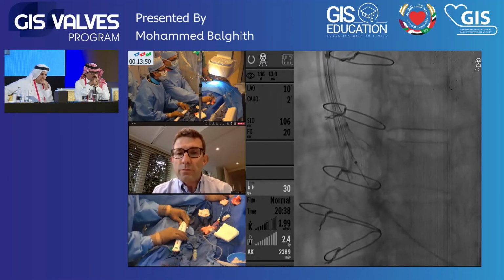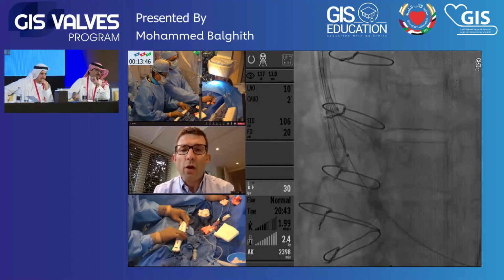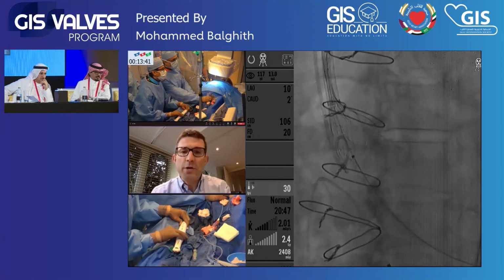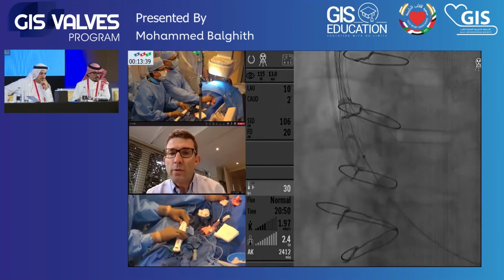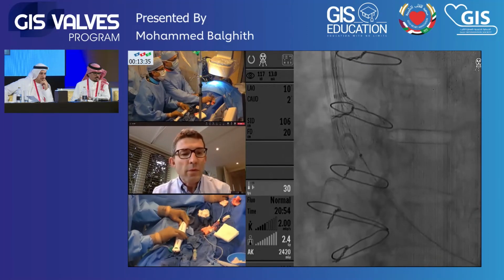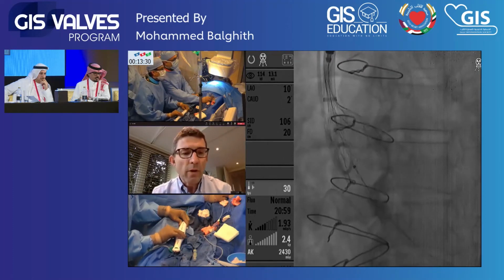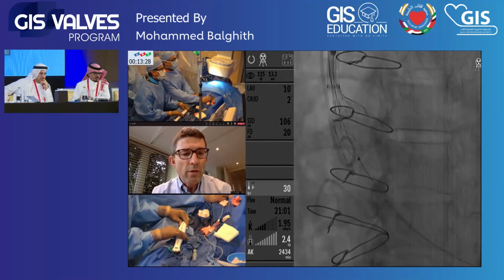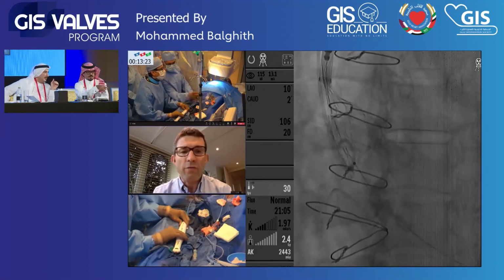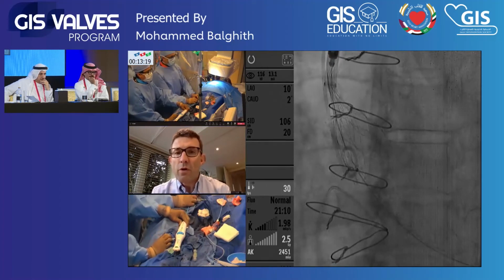I think it moved a little bit higher than what we want. I would go all the way now to the lock point so that you get anchorage on that left side. Don't move, please. I'm continuing. Yeah, that's good. Okay, you're going to hear the click soon. So you will hear and feel the click of the lock point of the Navitor. Yes, done. Yeah, it's there. Take a picture.